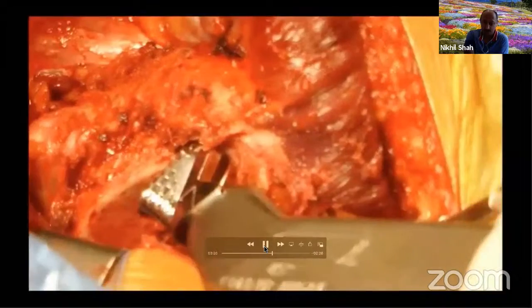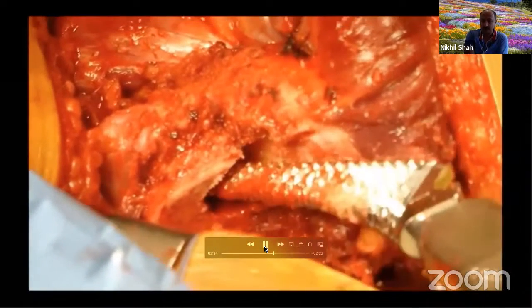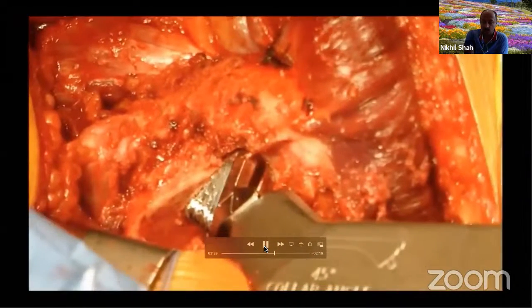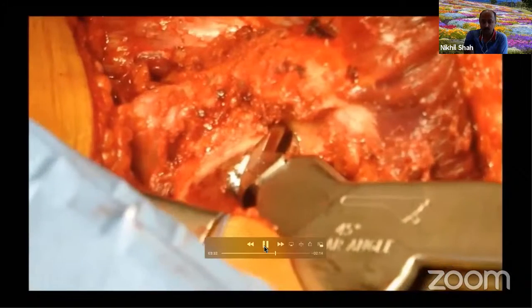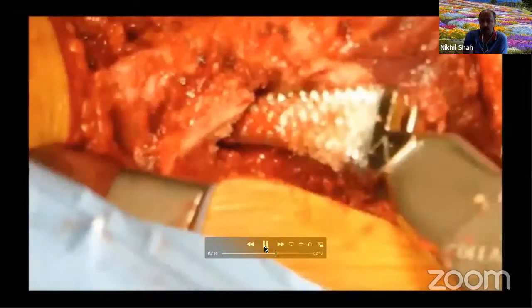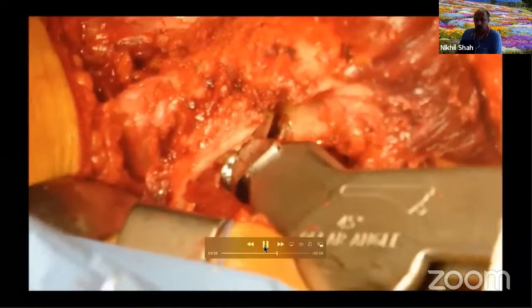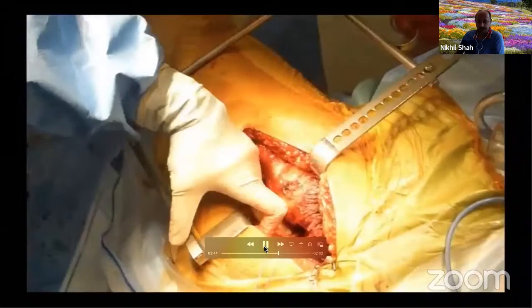And then that's the first broach going in. Generally we start, this is the C stem classic system. So I start with the CDH broach. Now the broach can easily cause a fracture. So what is important is to use the broach like a rasp. You only really use the hammer at the very end. The motion in the beginning is with your hand, and it's used like a rasp with front and back motions.